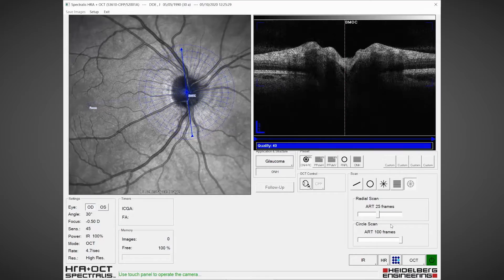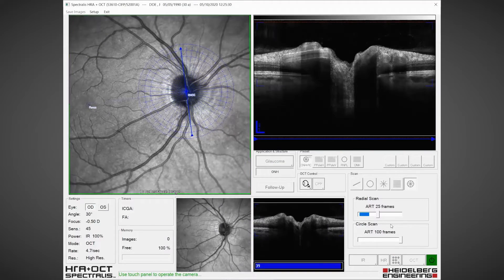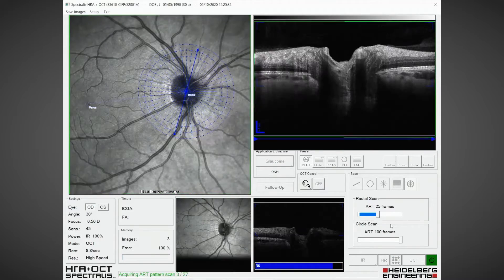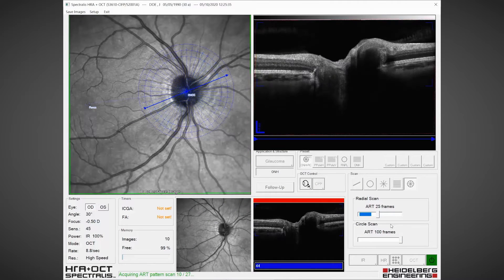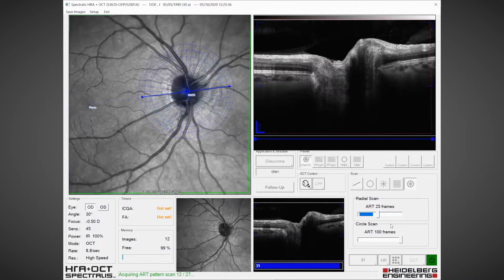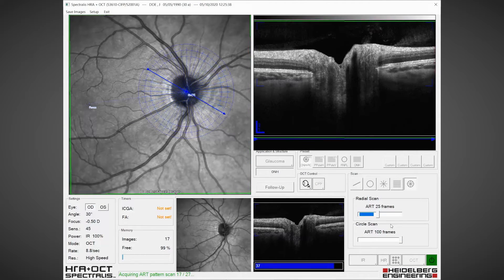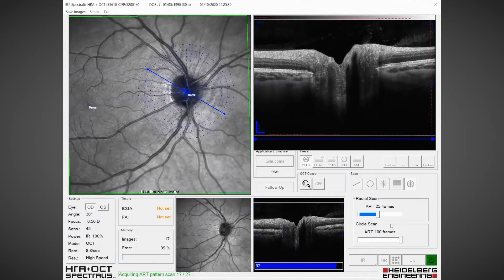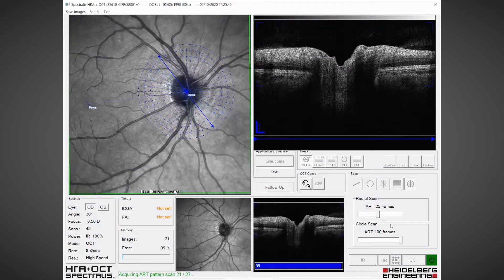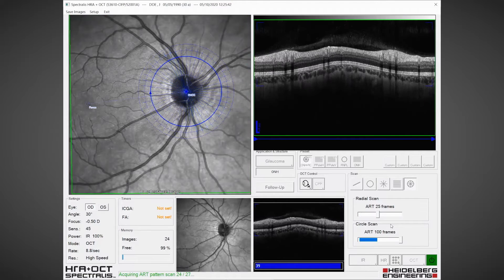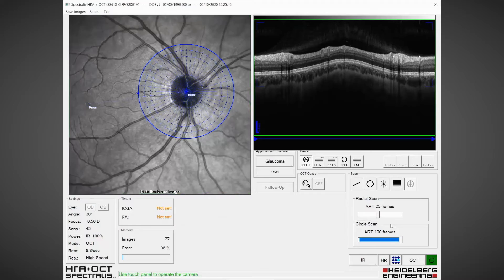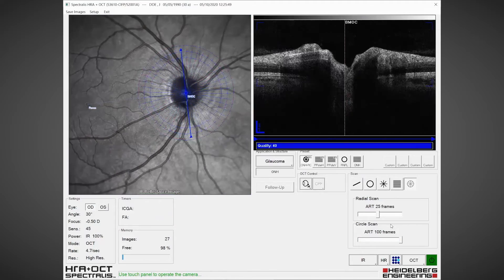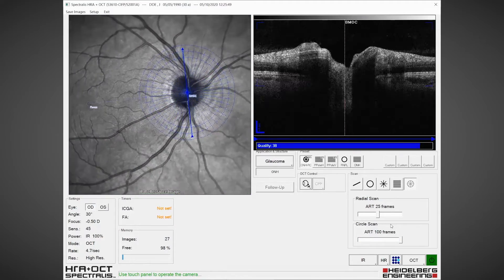I'm going to press acquire and we're going to do 24 radial scans of the optic nerve head and identify 48 locations of Bruch's membrane opening. Then we're going to do three nerve fibre layer circle scans: one at 3.5 millimetres, one at 4.1, and one at 4.7 millimetres.